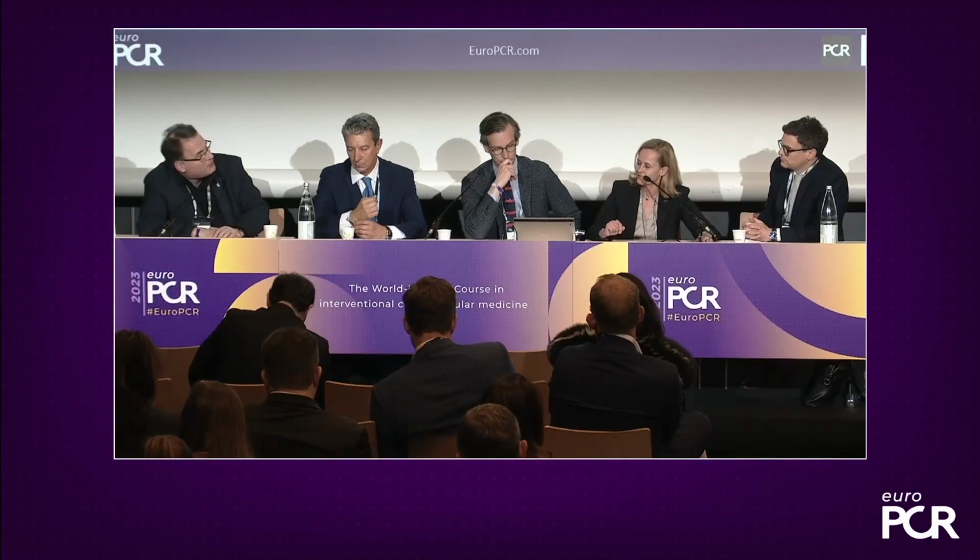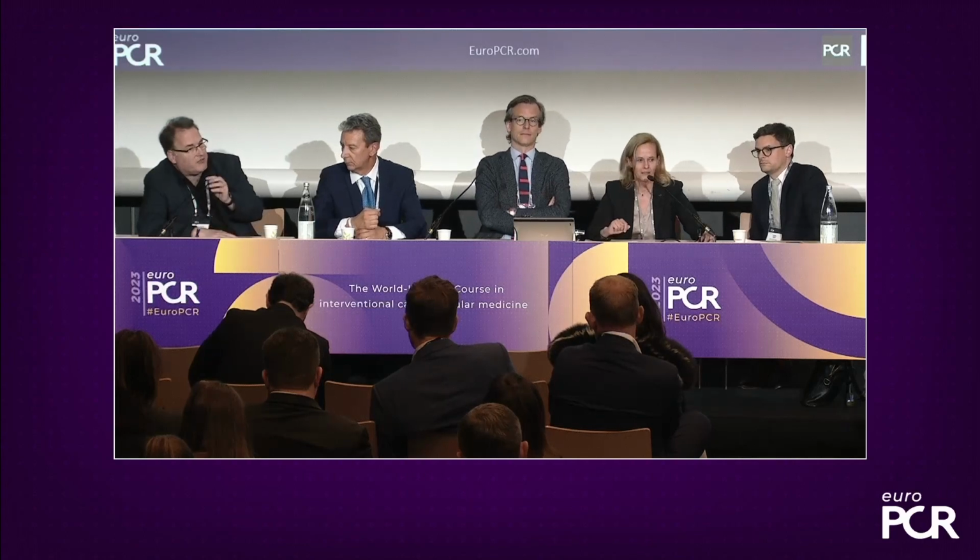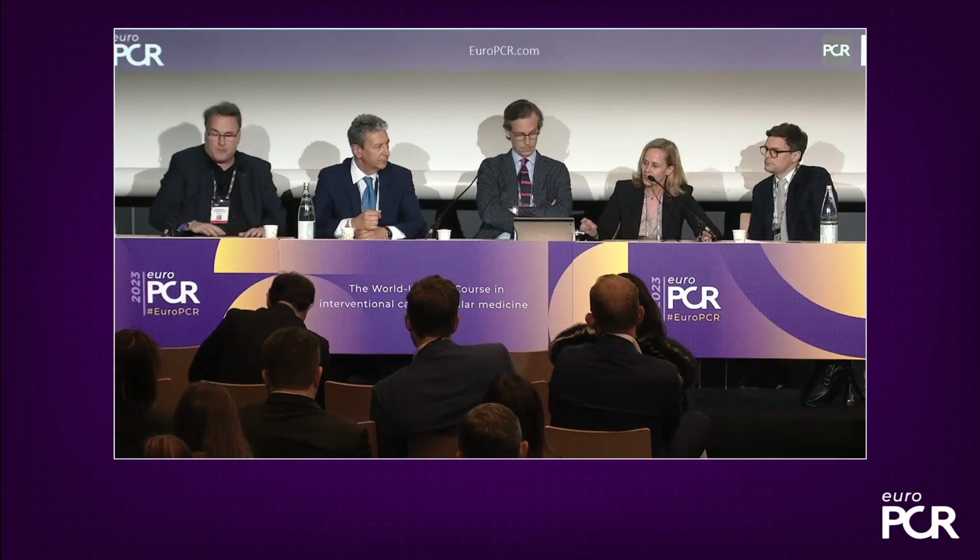And I think the more you move tricuspid, the more you go ICE in the future, and it's just the beginning of the journey. I wouldn't say we're at the end. It's not routine use yet, but it's, I think, a very important situation for something like 10-20% of the tricuspid cases, and I would say less of the mitral, and perhaps LAA. That would also be an indication to use ICE situations and to move away from general anesthesia, which is also different in different countries of Europe.